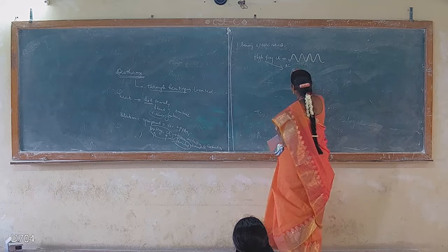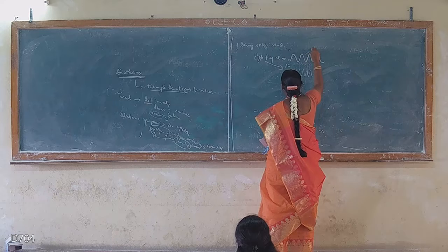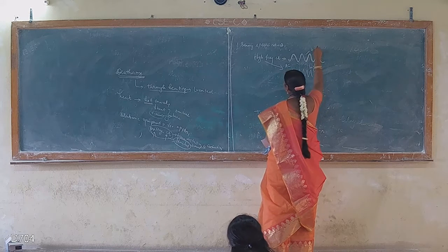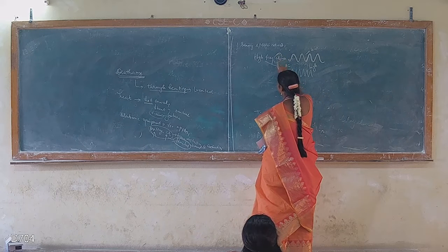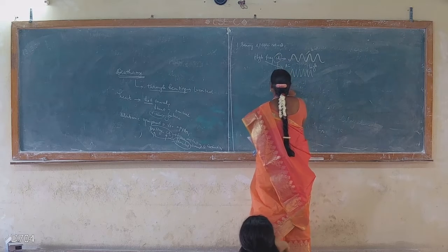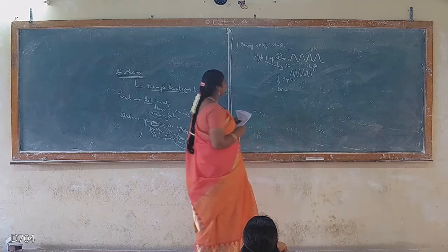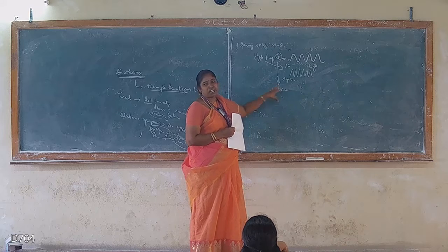It may contain any frequency. It may be low like this, or sometimes it may be high. Depending on the low and high frequency, the amount of current applied to the tissue will decide the depth. So high frequency current will provide the heat to the deeper lying tissues.